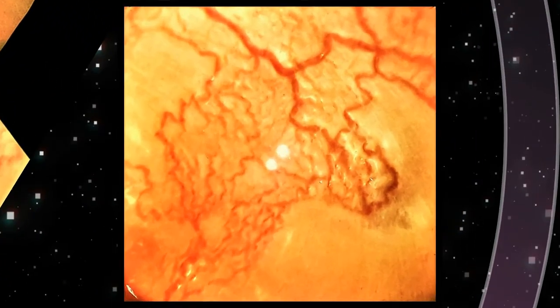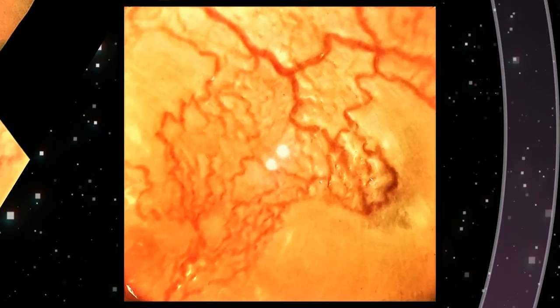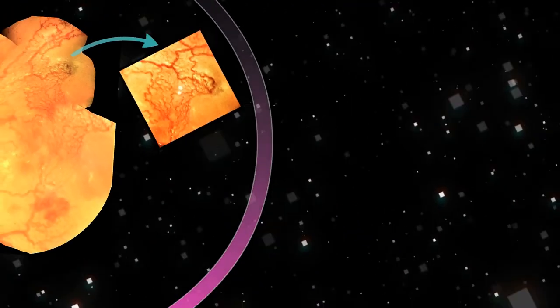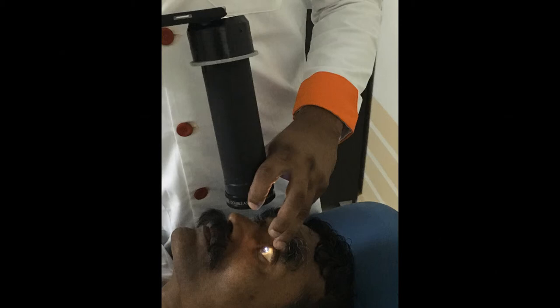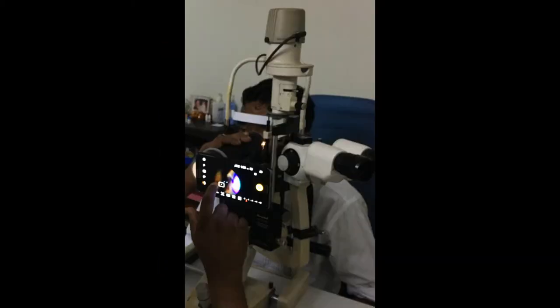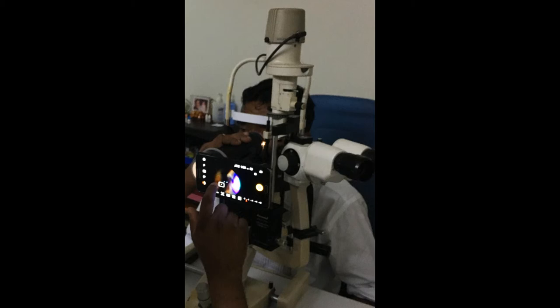This is probably the only picture in ophthalmic literature showing the close-up view of vascular loops in APROP, and this was taken with the direct cam. Smartphone-based ophthalmic imaging is cost-effective, portable, and has the ability to connect to various devices and networks. The images can be sent over the internet or on a cross-platform messaging service as encrypted messages.